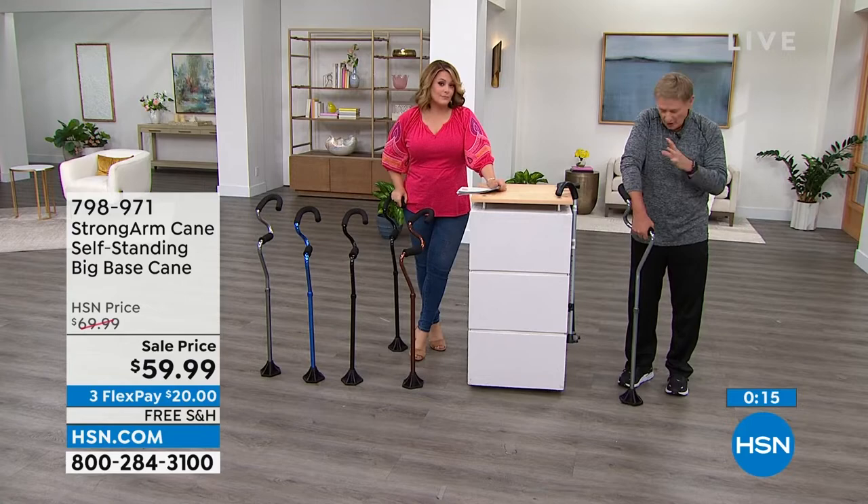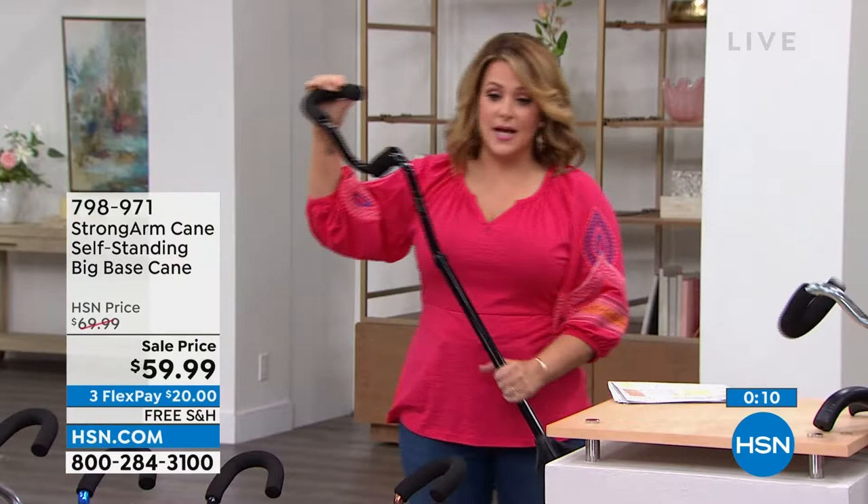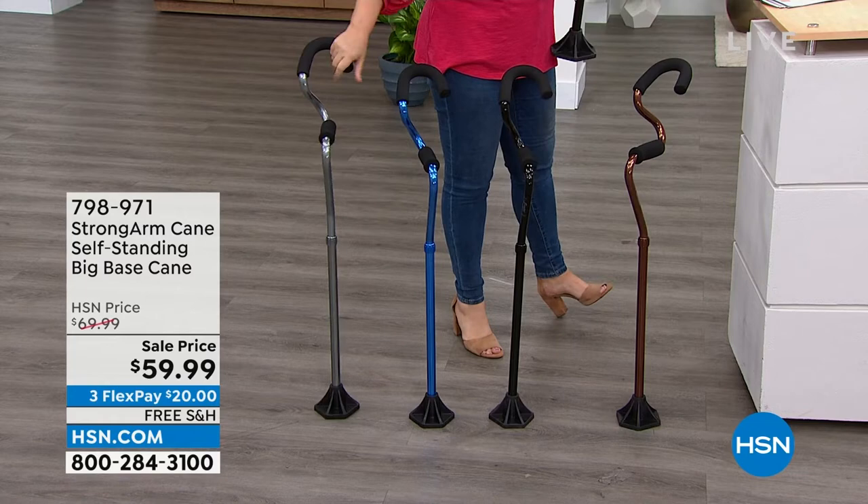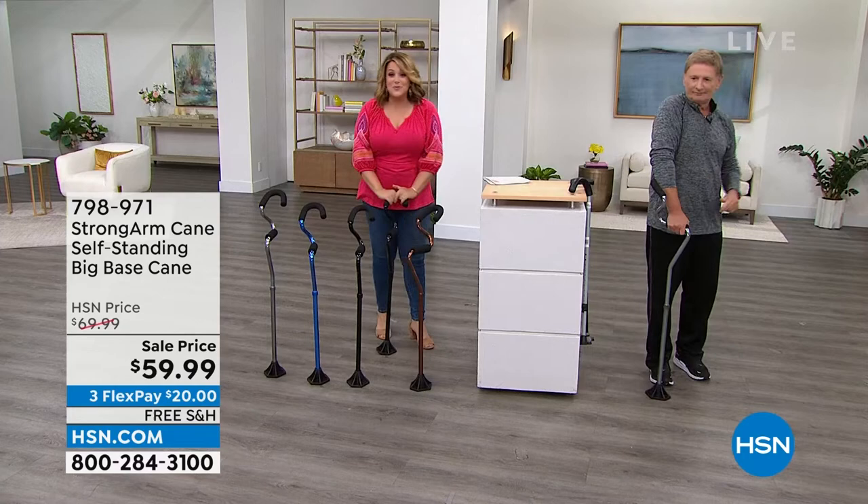It's such a genius design. If you'd like yours, it's on sale with free shipping and you have 30 days to love it or send it back. Choose bronze, black, blue, or titanium. Item number 798-971. 500-pound capacity, really well-made, five-star rated. Item number 798-971 — walk confidently.